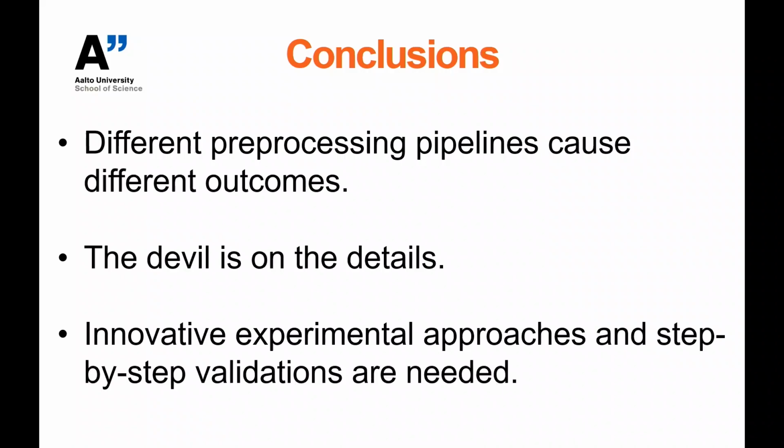Okay, so because we don't have the ground truth, that is one challenge, to actually objectively compare the different methods. But what personally concerns me about using independent component analysis in TMS-EEG type of data is that we have heavily time-locked signals. And ICA is constructed with the assumption that the components are statistically independent from one another. And I am concerned that artifacts such as the muscle artifacts, which are heavily time-locked, actually do accidentally mix with the neural responses. So that's why I would be quite conservative when it comes to time-locked artifacts.